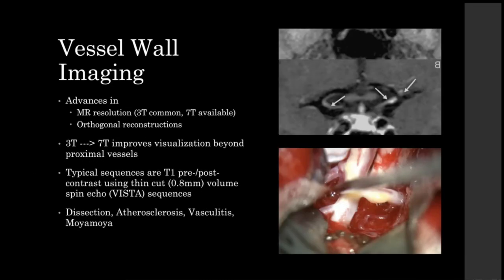This is a good look at a patient that I cared for. We know him well. We saw him recently with a proximal vertebral stenosis, for those who are familiar. And here you're seeing his vessels in a coronal view, but this is an intraoperative look at the intracranial vessel with the atheroma. Now this is a guy that if you made him a little bit younger, you could call this some moyamoya disease or occlusive disease, but that's clearly atherosclerotic disease intraoperatively.